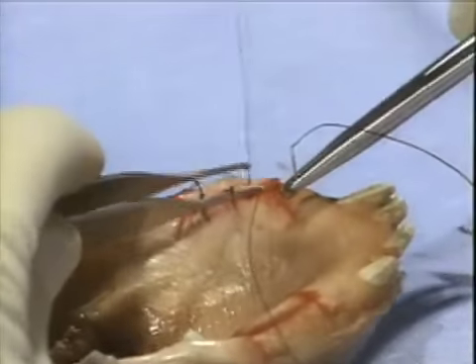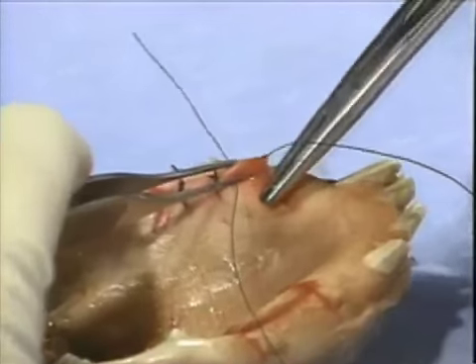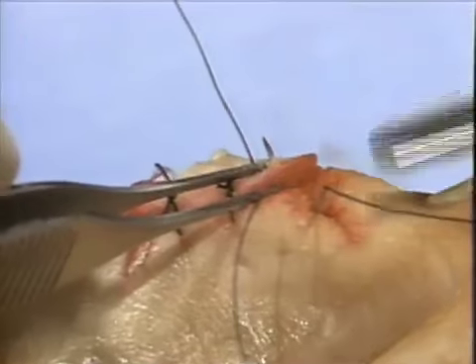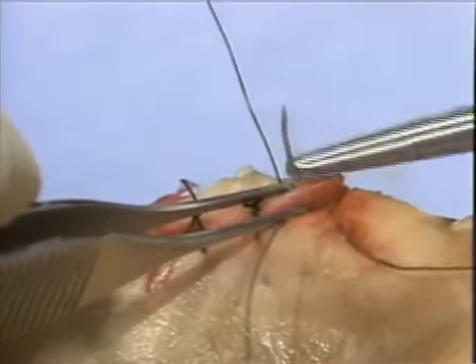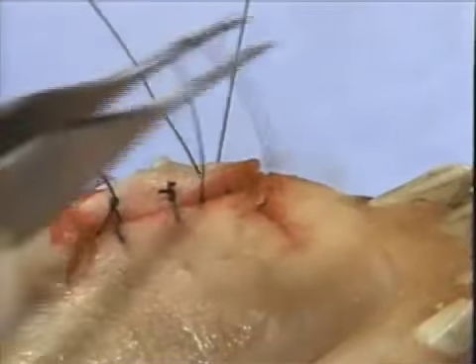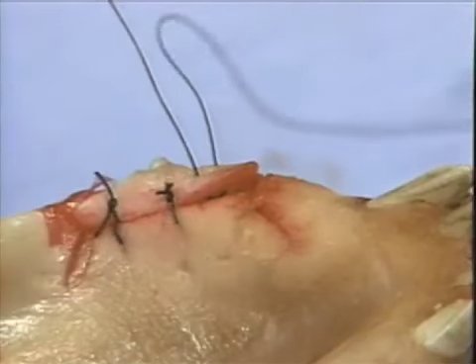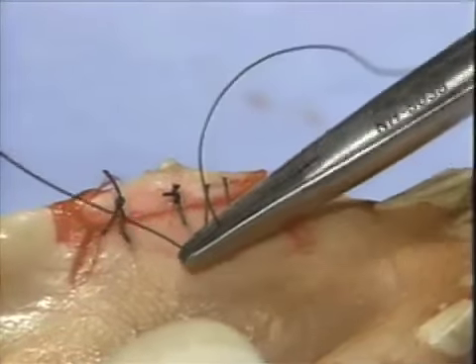The suture is advanced from the oral side of the flap through to the tissue side, and then is returned in the buccal flap from tissue to oral side. Hence, the internal part of the suture lies only underneath the buccal and lingual flaps, and suture material does not pass underneath the incision line itself, but rather external to the incision line.